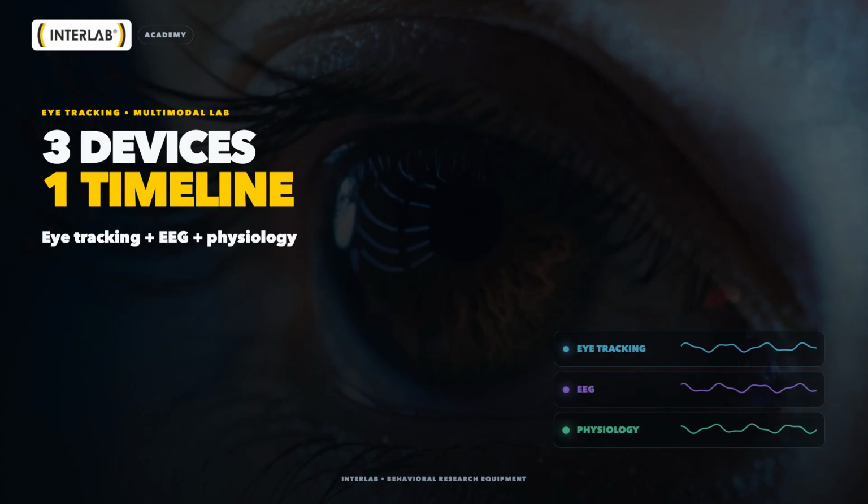The real challenge begins when we ask one question: what exactly was happening in the body at the moment the participant looked at a specific part of the stimulus? If 3 devices record data against 3 independent clocks, even excellent signals may fail to form a reliable story.